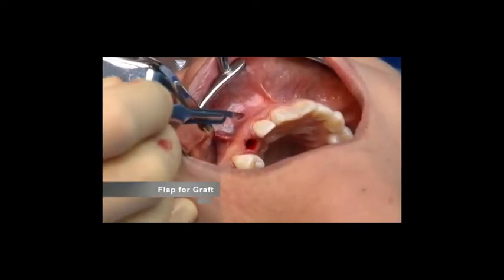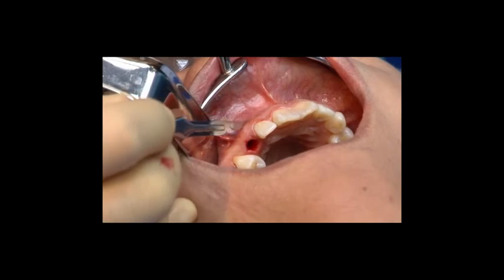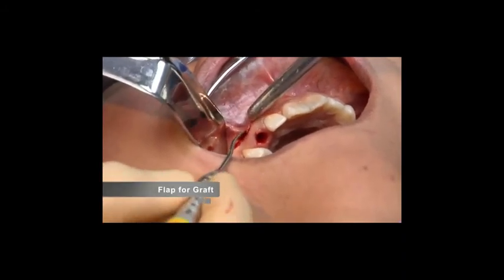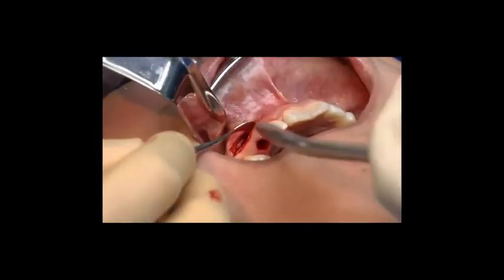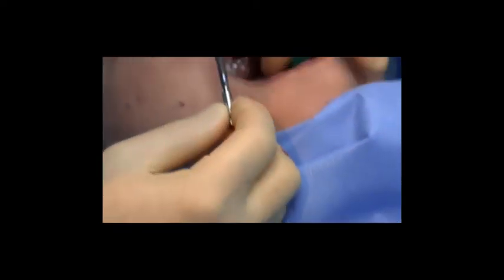So now that we have prepared the osteotomy site, we go ahead and access the apical fenestration for grafting. I did not want to make an incision crestally because we were going to temporize this case immediately. So we do an apicoectomy type of incision, kind of a semilunar incision through keratinized tissue. Make sure that this incision is in keratinized tissue. If you don't have any keratinized tissue, then that might be a contraindication for this type of incision. And then here, this is sped up a little bit, but a full thickness reflection of that apical flap, again, leaving the crestal area intact. This then accesses the apical fenestration.